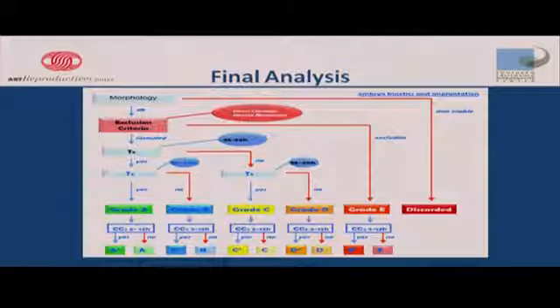And so at the bottom, you actually see there's some A+ type rankings all the way down to, well, in the end, discarded on the far right. But we can actually go through and rank them in those categories and be very, very specific to the physicians and the patient of which is the number 1, number 2, number 3 embryo, and what that grade would be.